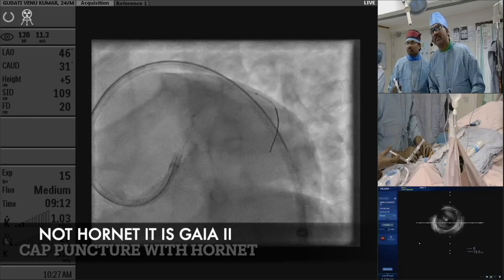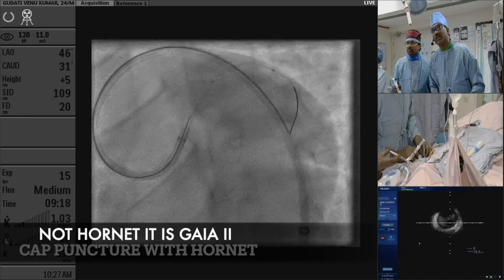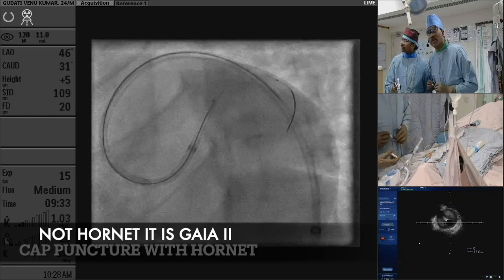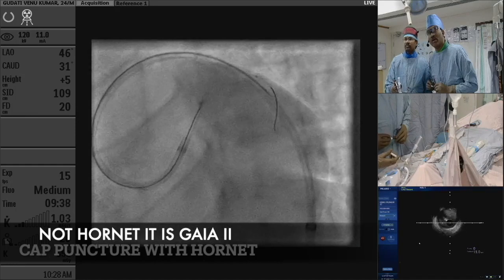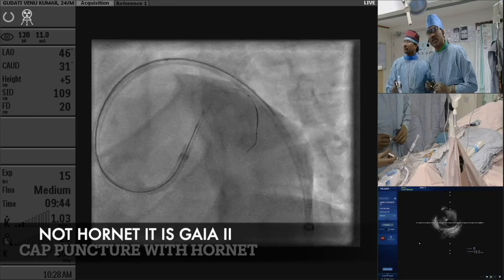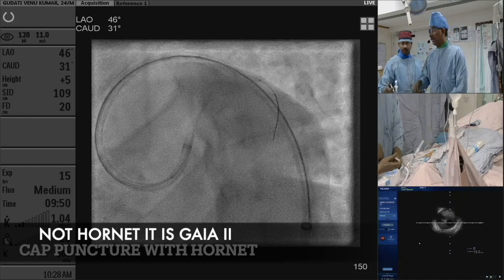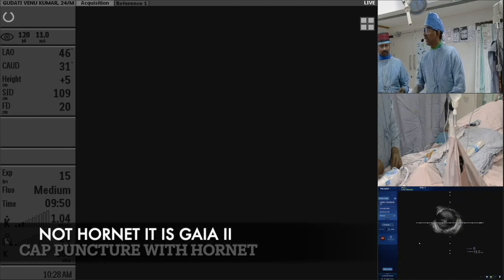And I think Crusade is going to give us a tough time here. Let me try. So I think it doesn't work this way. Okay, stop. Why is it not orienting? So we'll give a secondary wire.